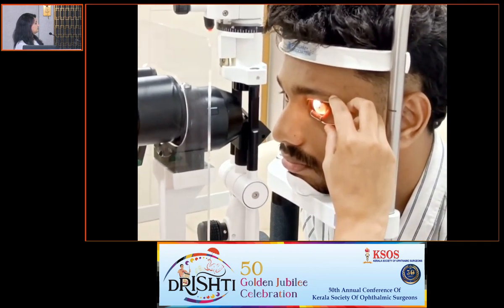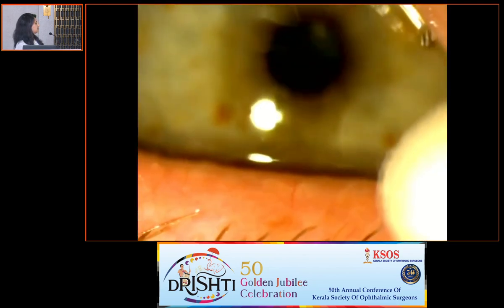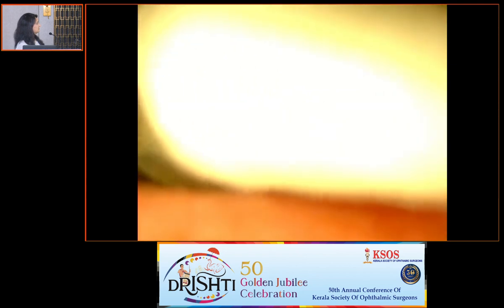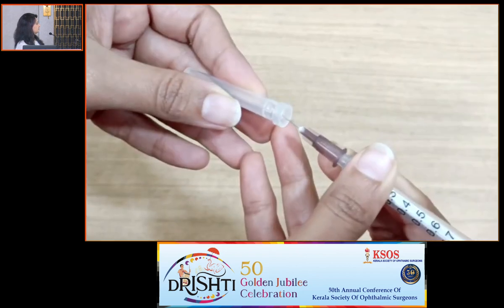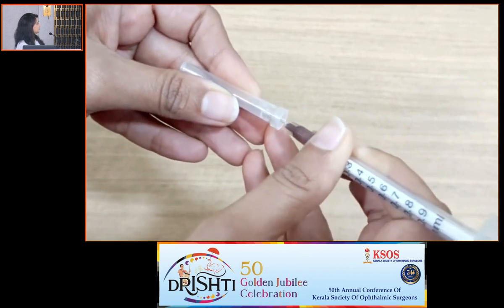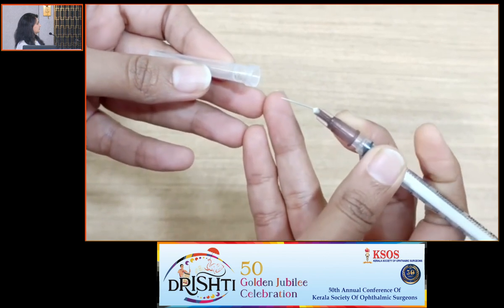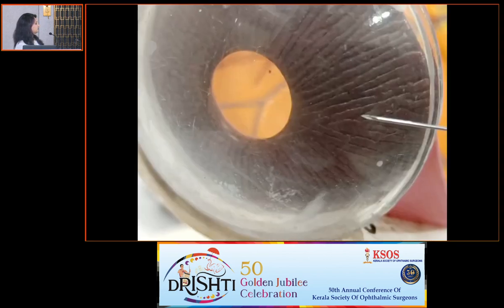If it's a very superficial, fresh foreign body, sometimes it can be removed just by a cotton bud. If this is not possible, then we need to use the 26 gauge needle. I would always advocate a minimal bending of the 26 gauge needle, as this would provide a safer method of removal of the corneal foreign body and also prevent perforation.